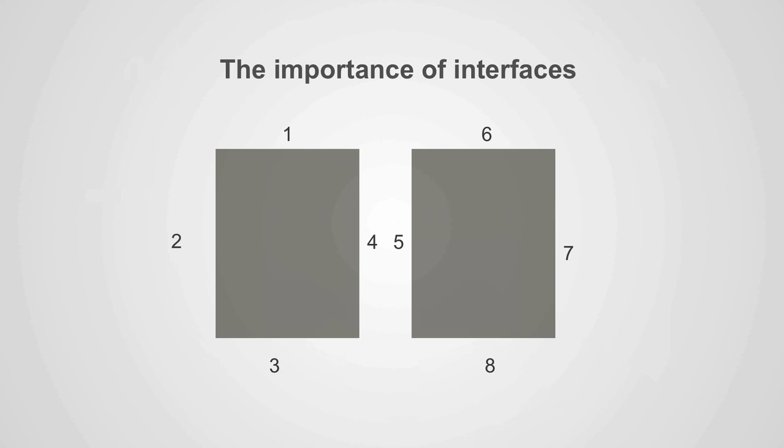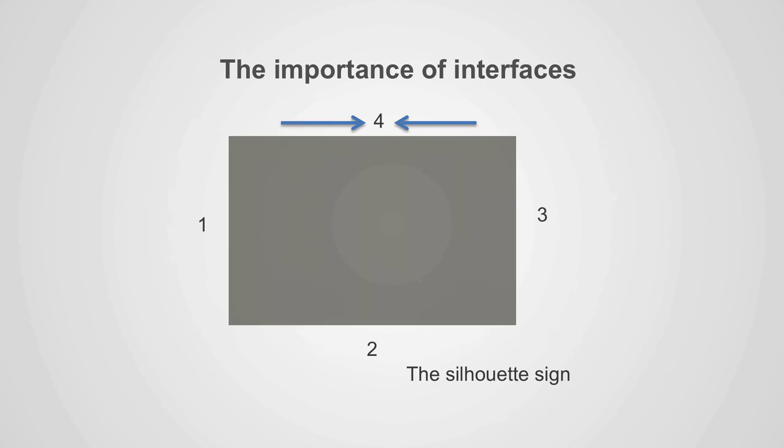When we separate the two rectangles again, we can again see them as separate structures because of the whiteness between them. Each rectangle has 4 edges for a total of 8. If the two rectangles are positioned so that the medial edges touch, on X-ray, we can no longer see the two rectangles separately, but see one larger rectangle, and we only see 4 edges. This is called the silhouette sign.